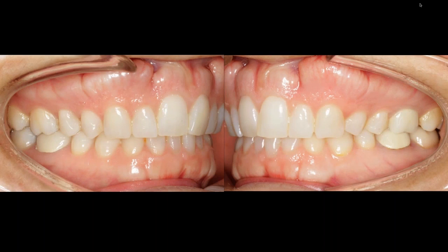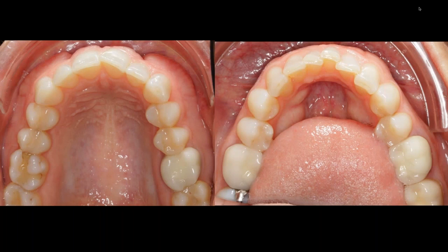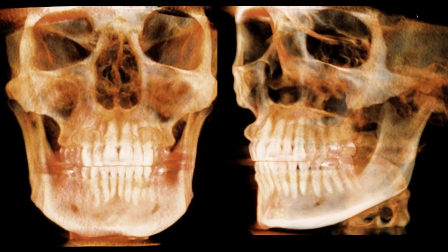Now, I've heard of some articles and doctors saying they can reduce the exostosis by using the perforations into this hard bone. It's not recommended. I don't recommend it. I tried a little bit of it. It's very difficult to get through, and I wouldn't do it again. But in this case, we're going to widen out her arches, upright, eliminate the crowding, and we're going to use manual osteoperforations to help us so that we can get the teeth to actually move.